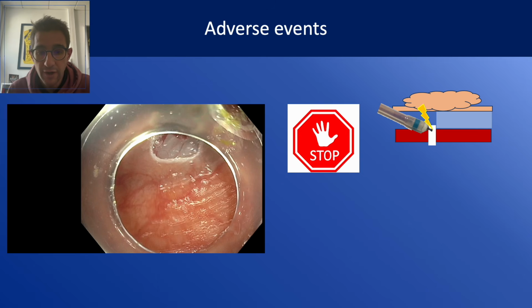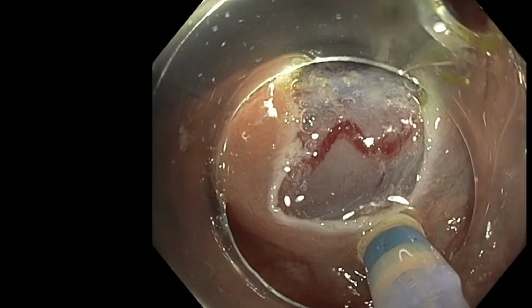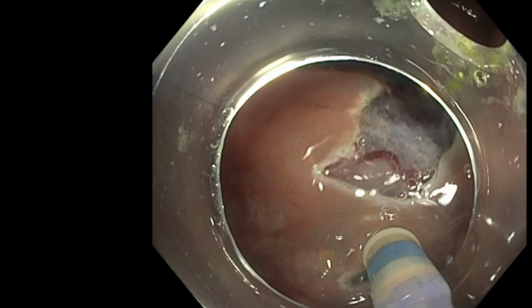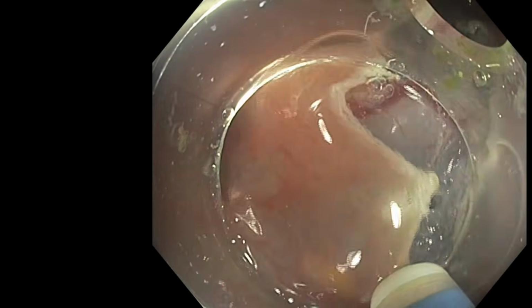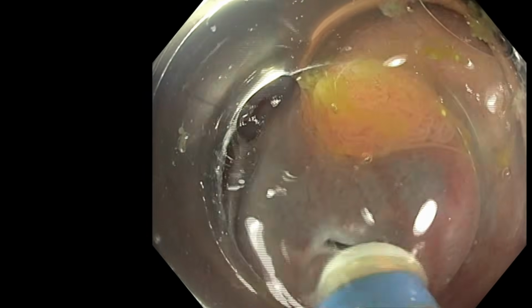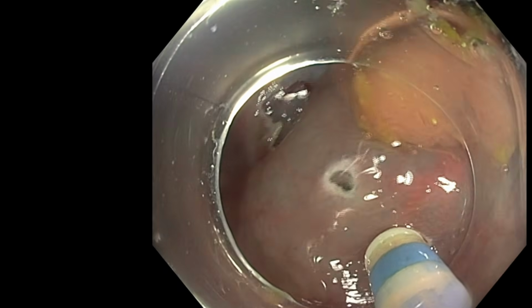You should be aware that perforation can happen sometimes in very unexpected locations, like here, for example. I didn't expect a double perforation in this case. It doesn't happen so much in my experience to have a perforation because of the small hole to inject better, but it's not catastrophic.